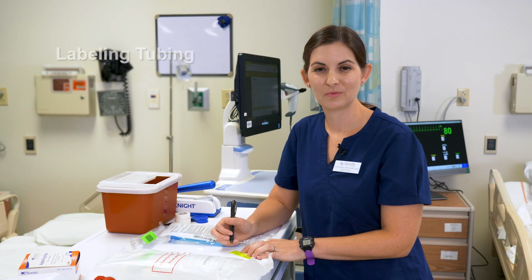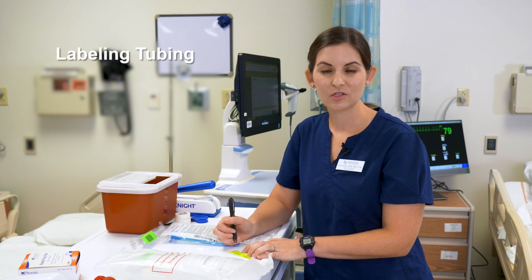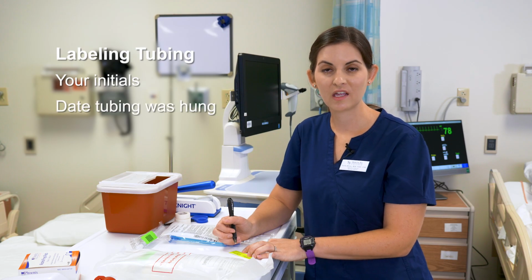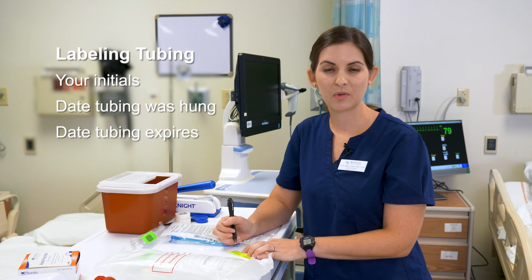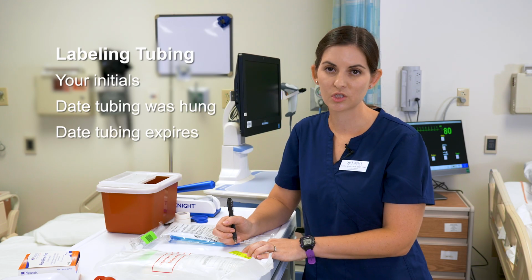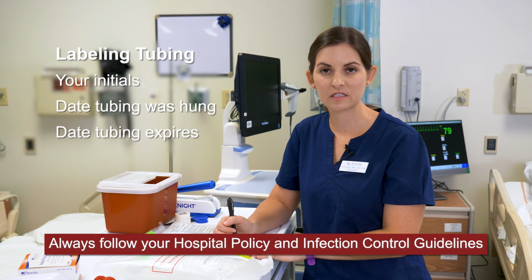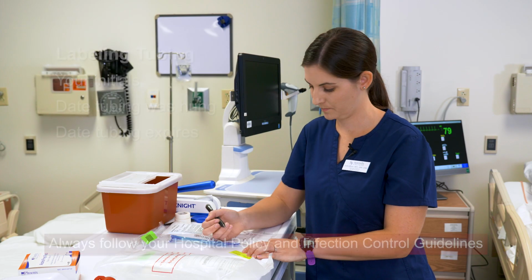When labeling your tubing, there's certain information that you need to include. For IV tubing, you need to make sure that you include your initials, the date that you hung the tubing, and the date that the tubing expires. The expiration does depend on whether you are using the tubing for continuous infusion or for intermittent infusion. Always make sure that you follow your hospital's policy and the most recent infection control guidelines.